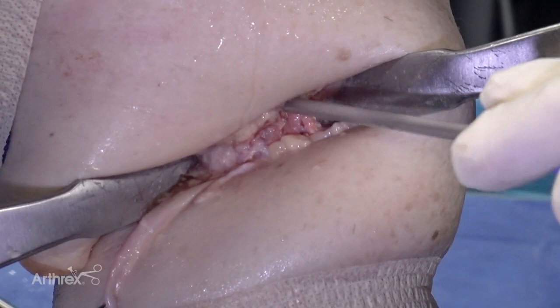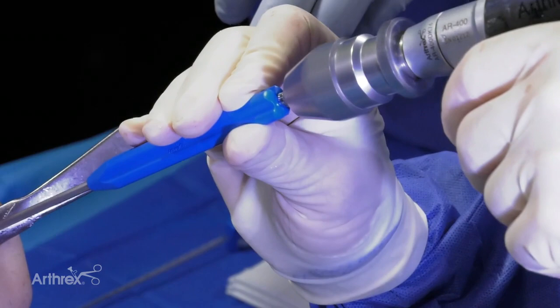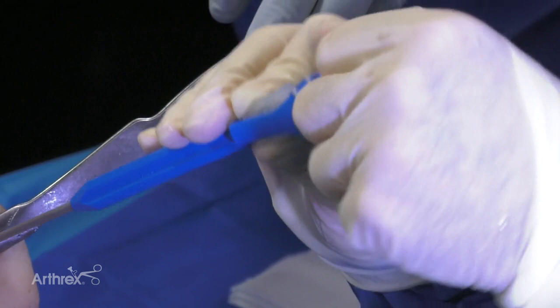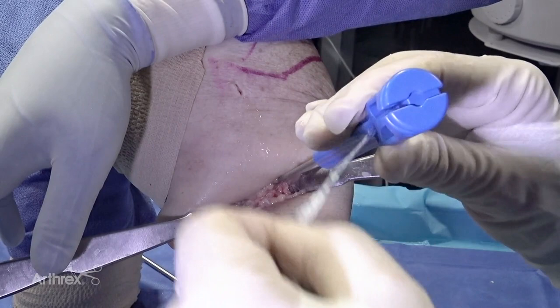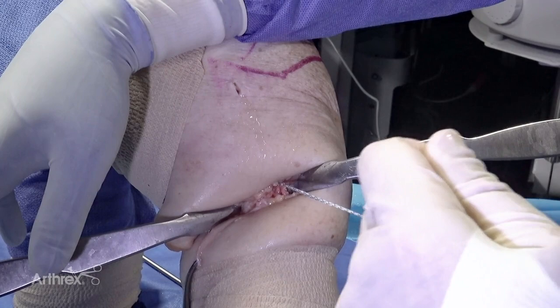And then at the upper end of the prepared area, we drill the hole. So it's a slotted drill guide. Anchor's inserted. Easily impacted. Then the needle casing is removed from the proximal end of the handle, it has all four needles neatly packaged. And then the inserter is removed. The sutures are removed from the slotted guide and the guide is removed. And the anchor is in position and tugged to verify that the anchor is holding.